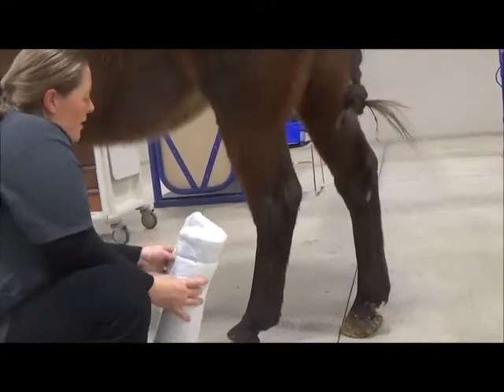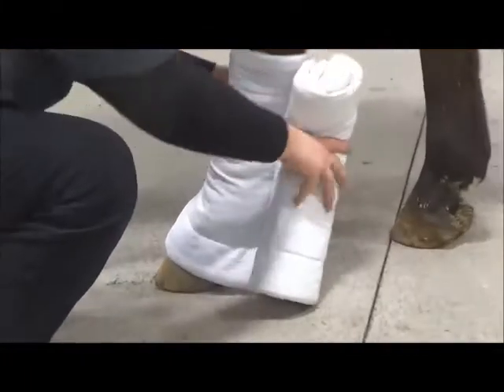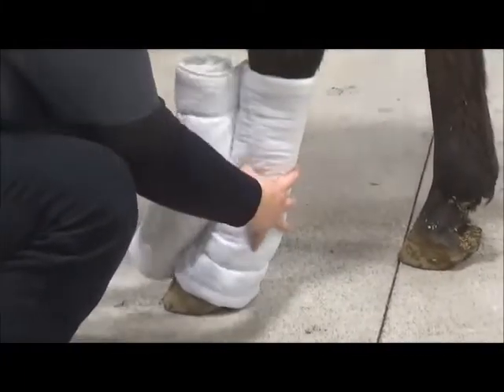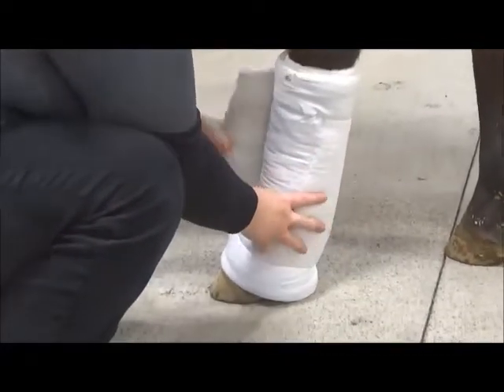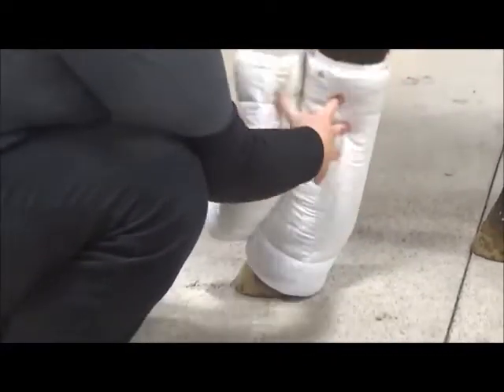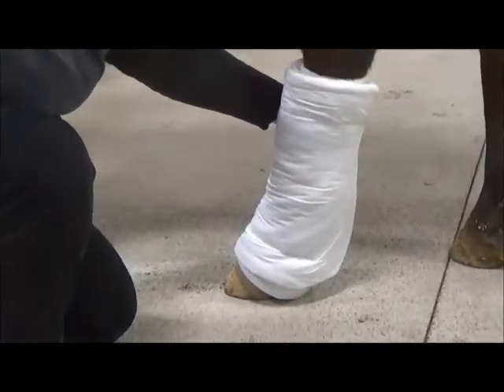So the first layer needs to go all the way down to the ground for the padding. And Ruby's standing very well right now with her foot in front of the other one, so I have lots of room to bandage. I always want to wrap from inside to outside, front to back.